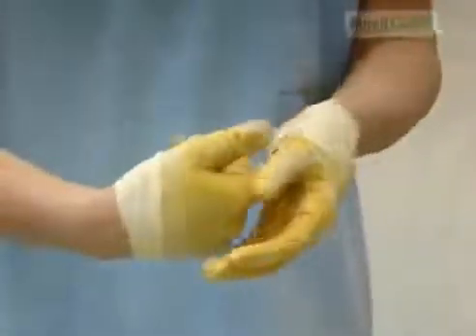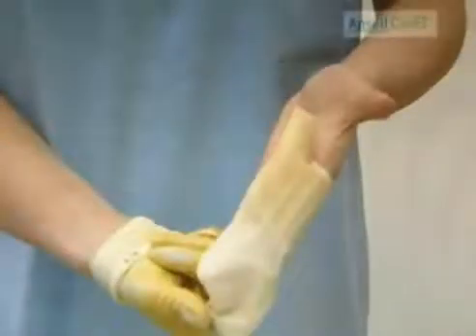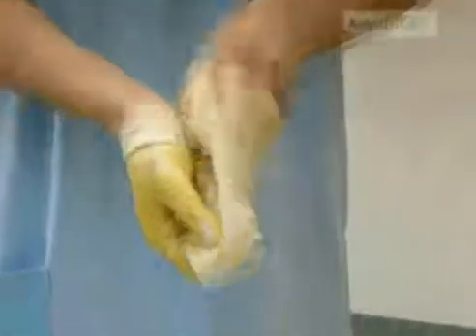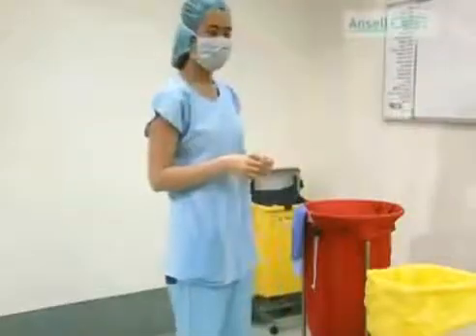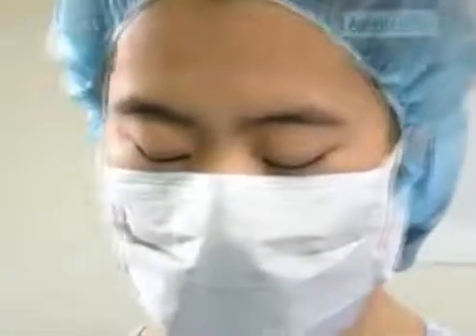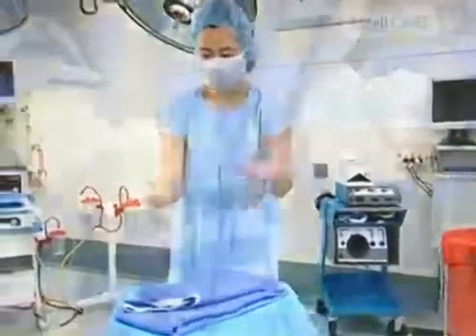Place your right finger under the cuff of the left glove. Pull halfway off, exposing your left thumb. Put this thumb, left, inside the right cuff and pull off, ensuring both gloves are inside each other. Finally, dispose of them in the infectious waste receptacle. This section briefly highlights various options available, but each hospital will clarify current practice within their hospital policy.